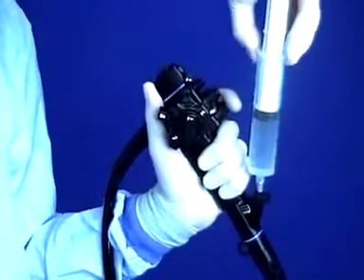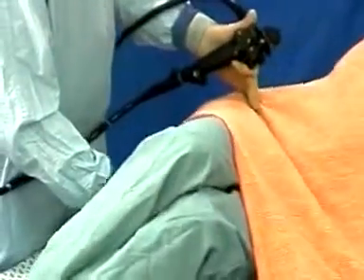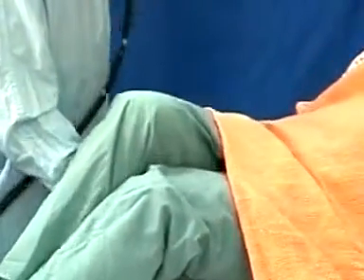Ileal villi are much more obvious under water, after injection with a 50cc syringe. If finding or entering the valve is difficult, position change may help, or try turning the valve to 12 o'clock. The biopsy forceps can also be used, either for blind biopsy, or when inserted, suctioning to collapse the cecum and slide the tip into the ileum — the forceps acting as a guide wire.